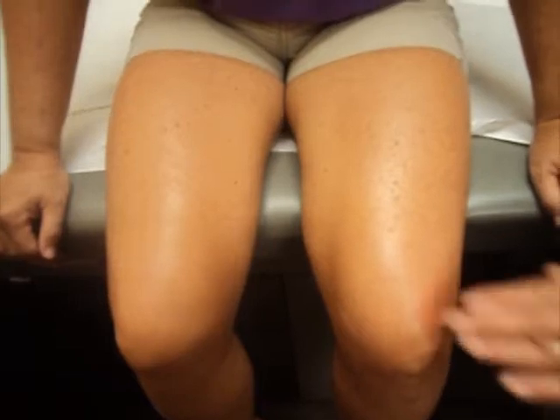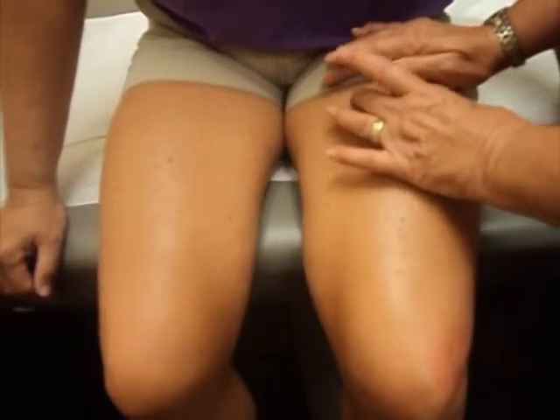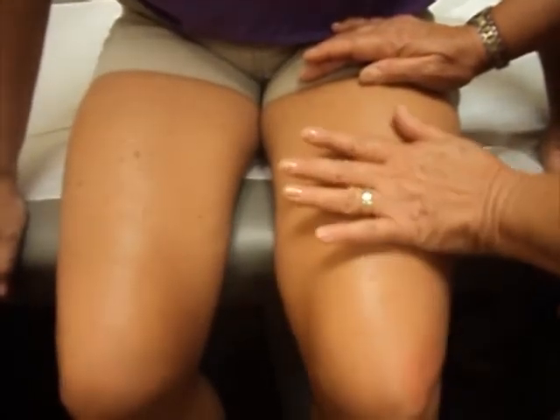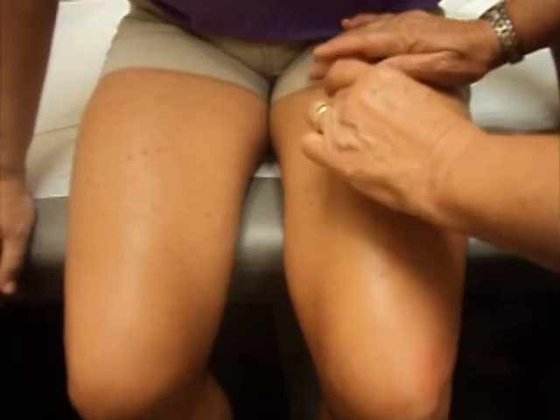First, let's talk about the thigh, because that is the easiest for someone giving a self-injection. Okay, to find the proper injection site, it's very easy to locate. You put one hand over the knee and one hand around the hip, and you have this middle area to give the injection. In this area is a large muscle, and it can be given anywhere in this area, and what you want to do is just aim off from the side a little bit and go off center.